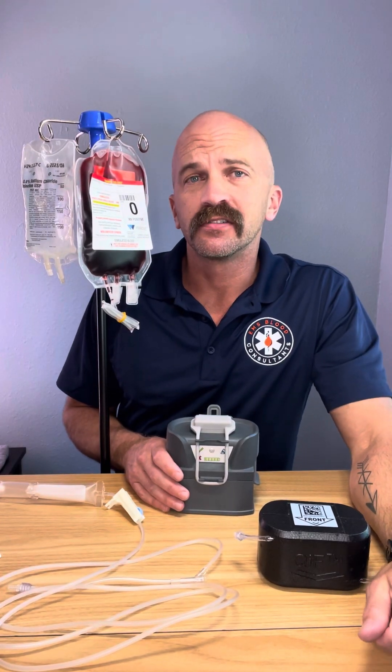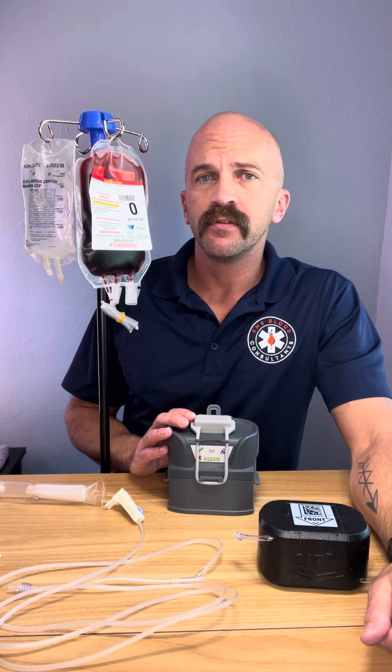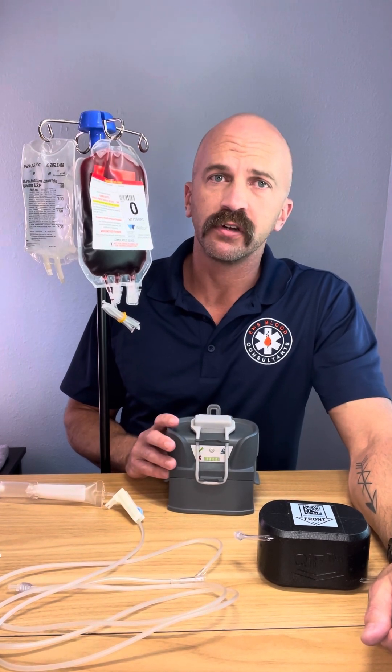Hey guys, Kent with EMS Blood Consultants here. Today I've got the Q&Flow Warrior Light Blood Warmer. This is a great warmer for transfusing blood in the field.